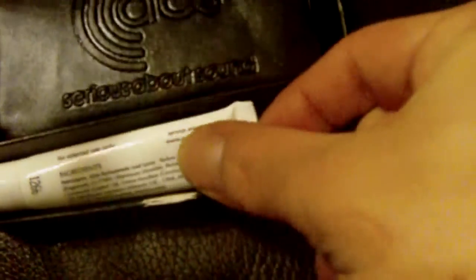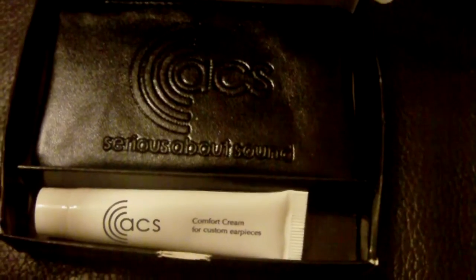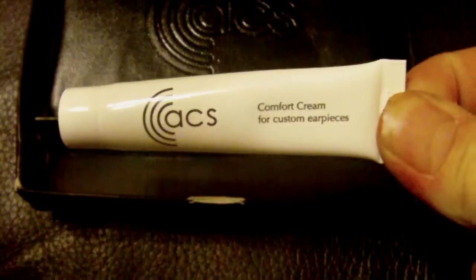Open the box — this is how they come. Inside is ACS's comfort cream, you just spread a little bit of that on your plugs every now and then. If you remember, all the way back in October, went to the BPM show, got some molds done for some custom earplugs with the filters in and they turned up and they're absolutely fantastic. Just showing you how they turned up in a box like that.